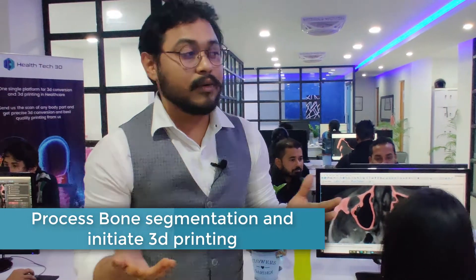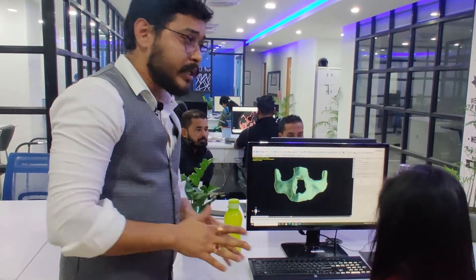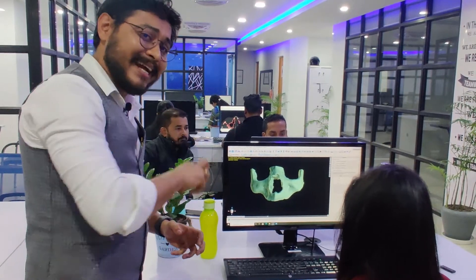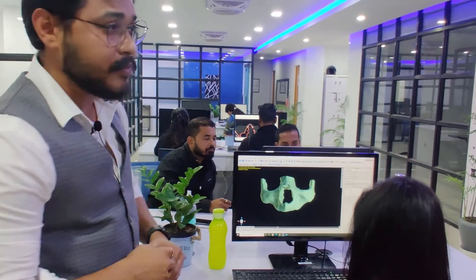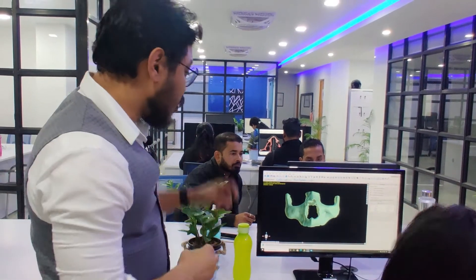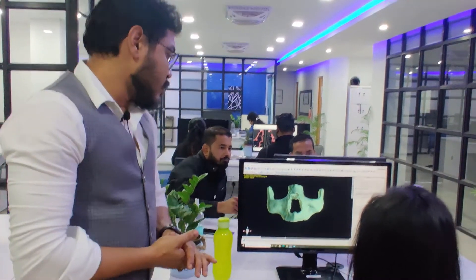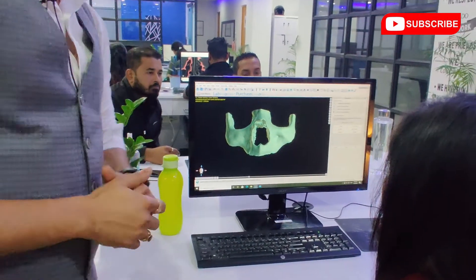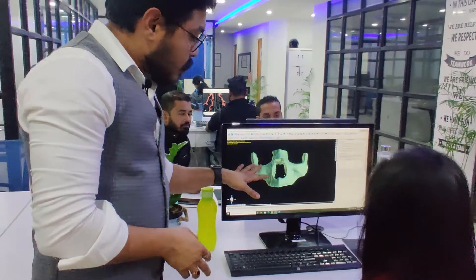For bone segmentation, you simply drag and drop the DICOM file received from the CBCT scanner into the Blue Sky Plan software. We believe Blue Sky Bio is the most useful and precise software for bone segmentation.